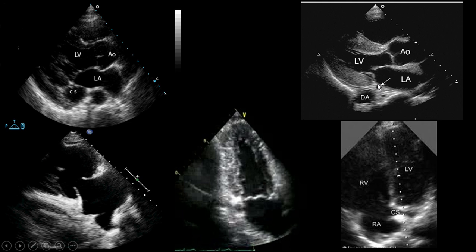In some patients, this coronary sinus is prominent. Generally, when you see a prominent coronary sinus, measure it. If the diameter of the coronary sinus is more than 5 millimeters, you have to think about some venous anomaly, at the top of which is a persistent left superior vena cava. For example, in this patient, the coronary sinus is very dilated and almost bigger than the descending thoracic aorta. The coronary sinus can be detected in different views too.